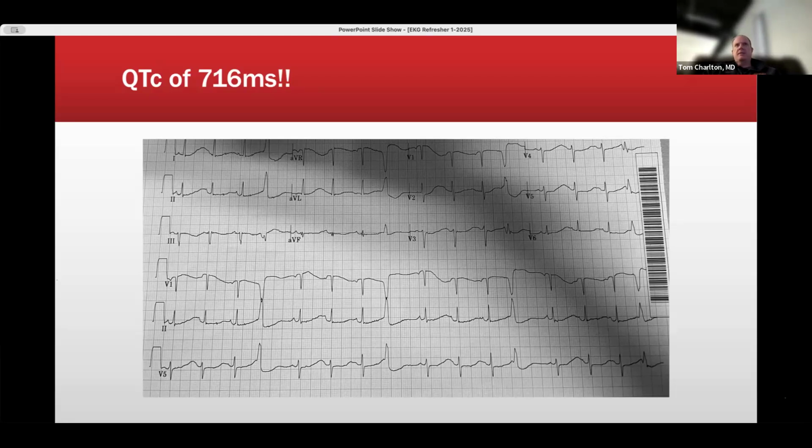Now, I want you to think about this. Otherwise healthy 32-year-old female who passes out before having breakfast. How much of a work-up do we need? Yeah, this probably was just she was hypovolemic or whatever. Yeah, no. She had a QTC of 716 milliseconds. We get concerned when it's over 500 milliseconds, and we get super concerned and put pads on you when it's over 600 milliseconds. Hers was 716 milliseconds.